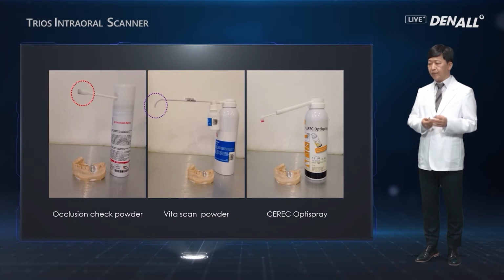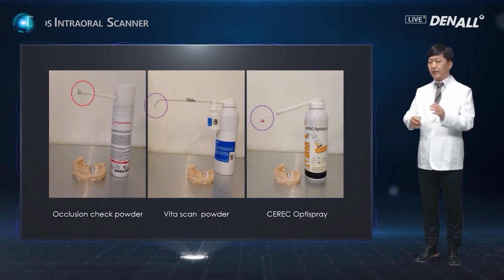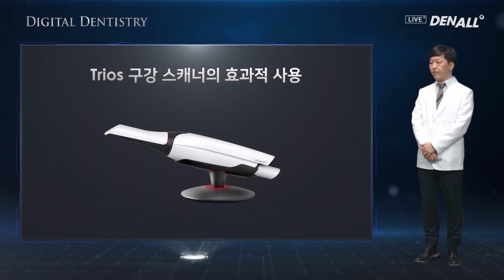The second is the Vita Scan powder, and the third one is Cerec Optispray. Based on my experience, they create an appropriate surface to be scanned.